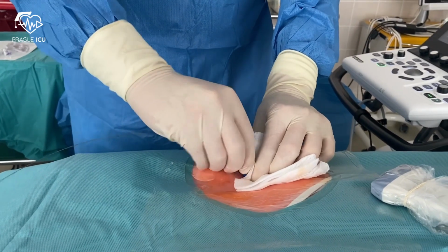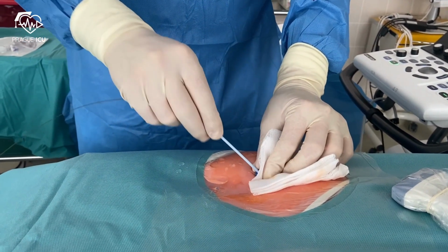Finally, remove the introducing dilator while leaving the wire within the sheath.